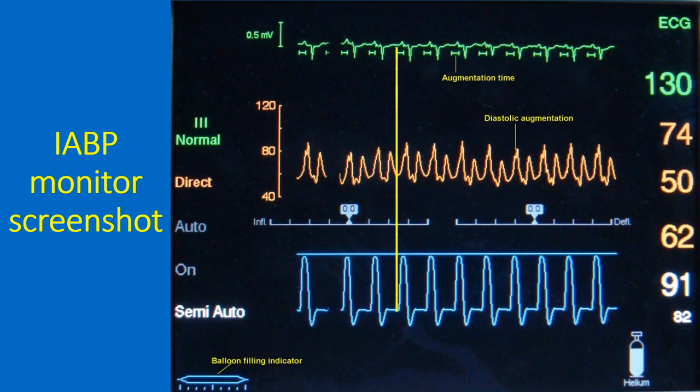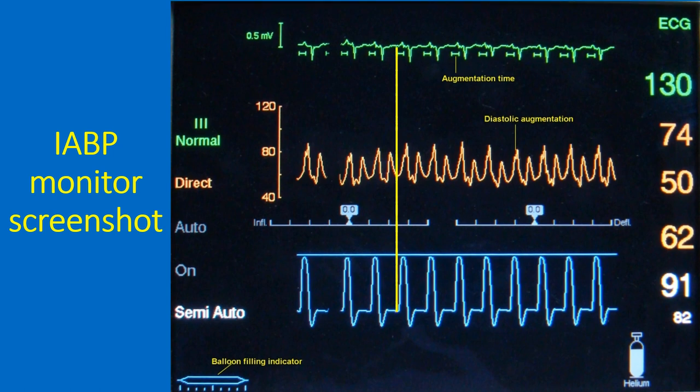The figure at the top in green, showing 130, indicates the heart rate. The figures below that are the peak, trough, and mean pressures from the arterial line. The augmentation level and alarm limit for augmentation are shown as the lower figures, and the filling level of the helium tank is also indicated.